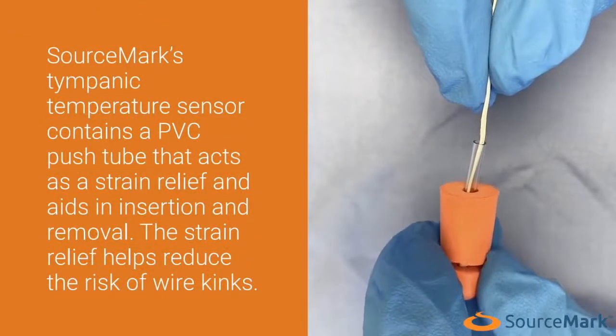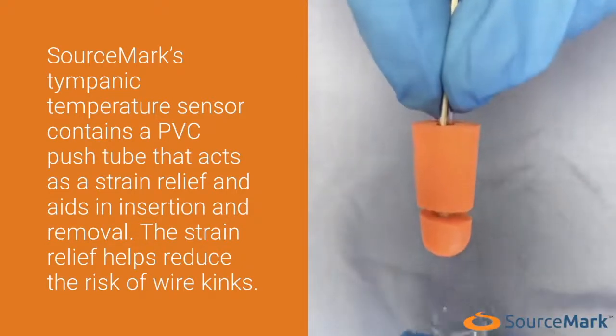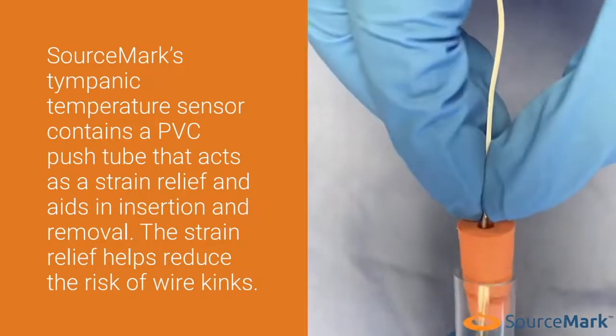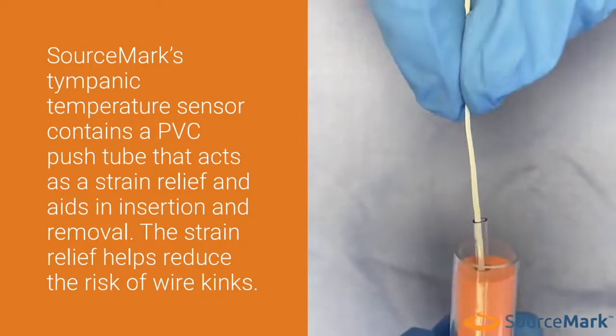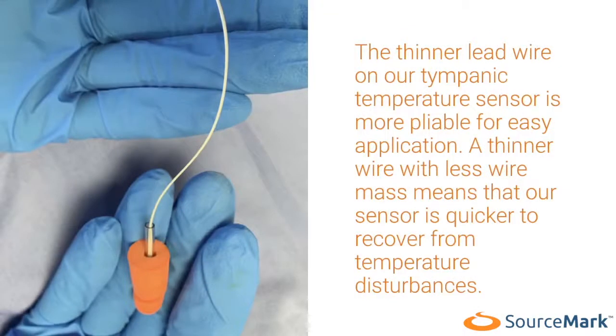Sourcemark's tympanic temperature sensor contains a PVC push tube that acts as a strain relief and aids in insertion and removal. The strain relief helps reduce the risk of wire kinks. The thinner lead wire on our tympanic temperature sensor is more pliable for easy application.